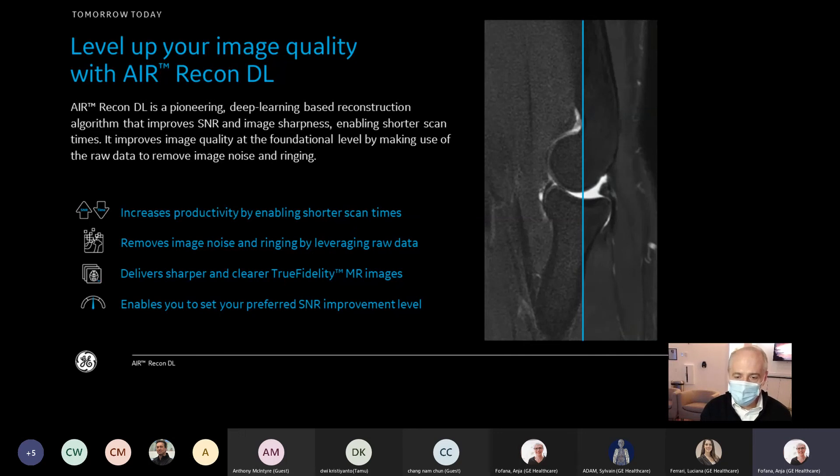Users have full control over the level of Air Recon DL they select. You'll see that you can use a high, medium, or low setting based on your preference and based on the amount of noise in the image. You can select this directly from the scan protocol.